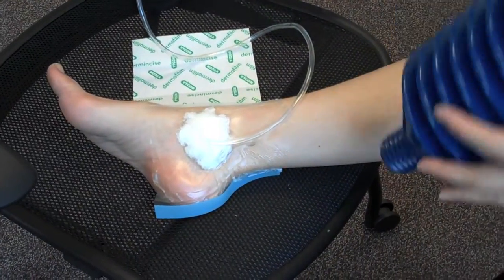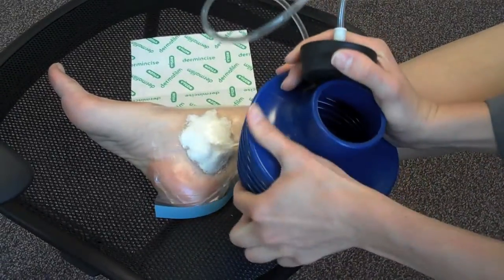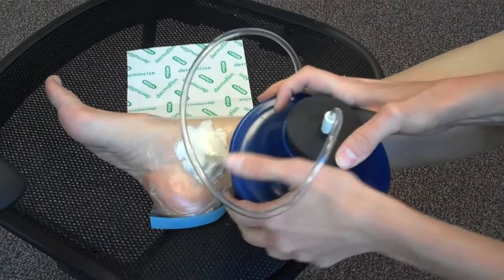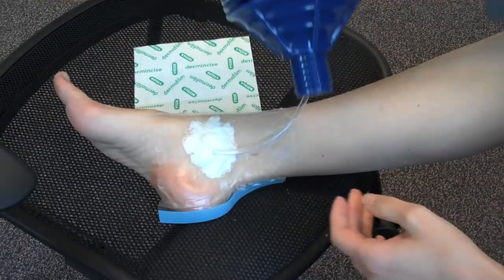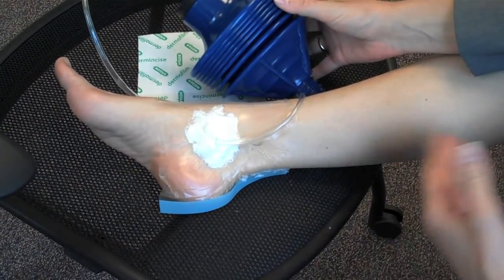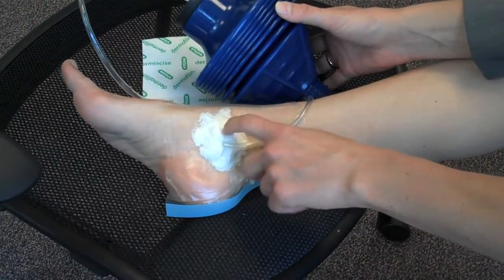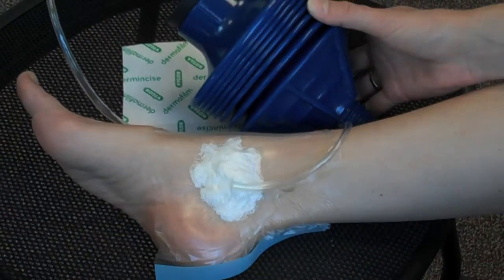Then, take the device and compress the device, which is the pump. Make sure that your plug is inserted airtight. And now, your pump is set, which will pull on your wound dressing for 24 hours a day, 7 days a week. And your dressing is now hard, because it does not have any air in it, and has a vacuum.